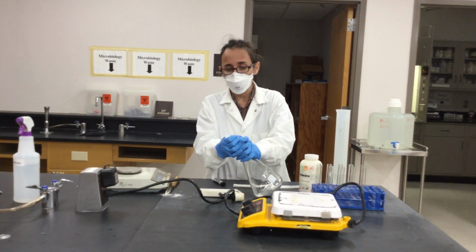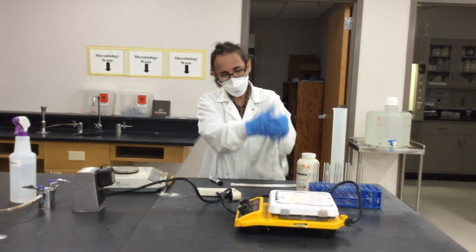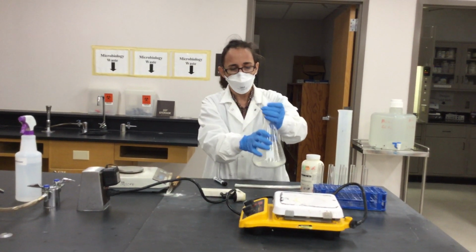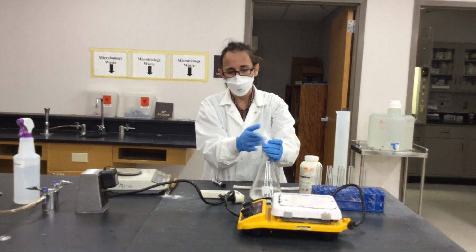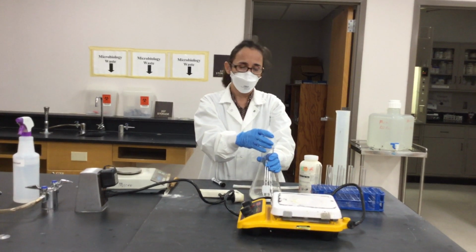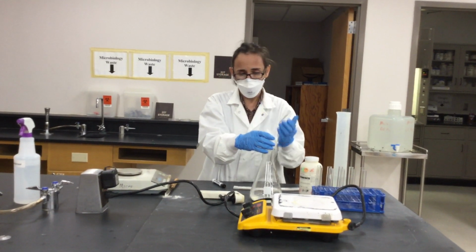So you have to pour your media into the bottom of the flask, and you can see how it's becoming cloudy, just because, like I said, this powder is very fine. You don't want to inhale that. So double purpose of using the mask right now.